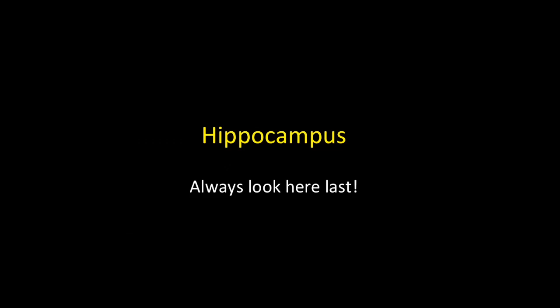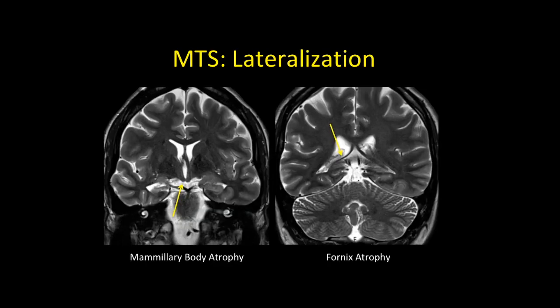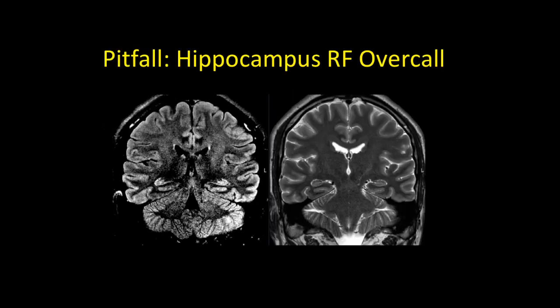Finally, the hippocampus — always look here last, save the best for last. The most common finding is mesial temporal sclerosis, which requires three findings: volume loss, T2/FLAIR hyperintensity, and architectural distortion. You need all three to call MTS. Remember that approximately 10% of cases have bilateral pathology. A helpful trick is to look at secondary signs: the output of the hippocampus through the fornix to the mammillary body. In this patient with right MTS, the right mammillary body and right fornix are atrophied.